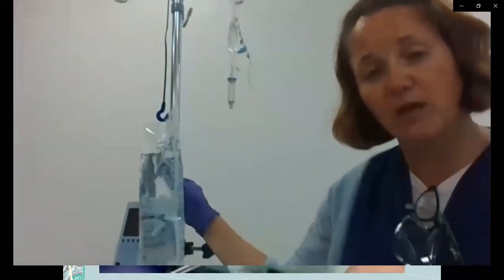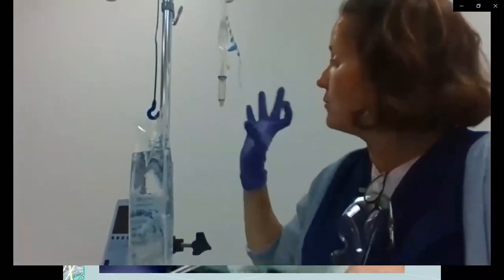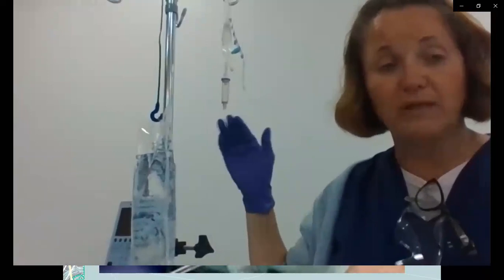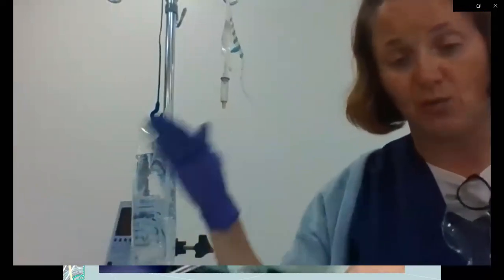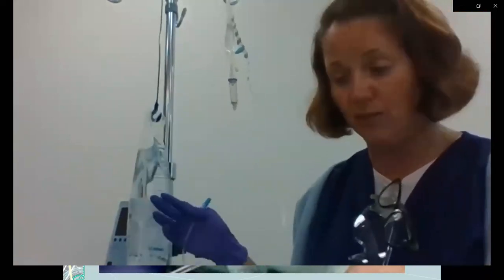So remember, just like we talked about with the water and the air getting out of the line, primary versus secondary is also going to work on the principle of gravity. Whatever is higher is what is going to go in. This medication is what we want to be administered. We want it to be what goes in. So to be able to get that to happen, we need it above the primary line. If it is below the primary line, the primary is what's going to run.